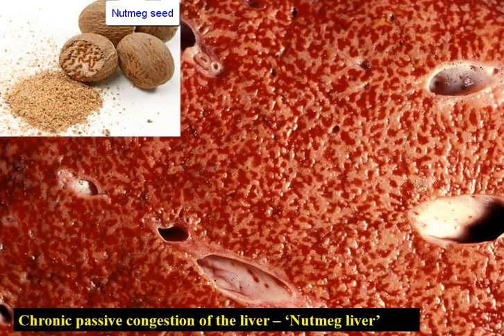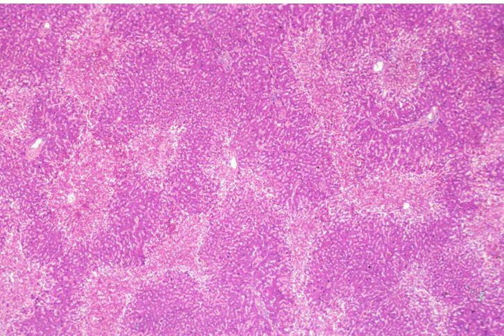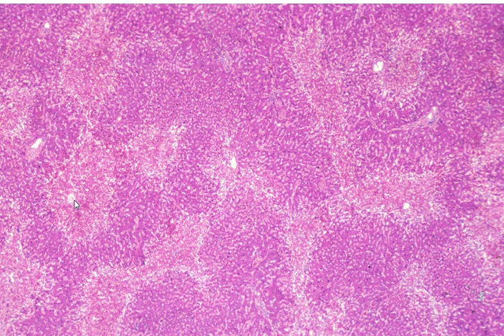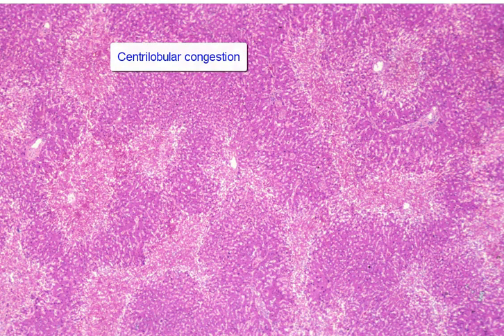So what does nutmeg liver correspond to? If we examine this under the microscope, we will see there are two different colors in the areas I am highlighting here. These are areas of marked congestion, and again another area here, and these are around the central vein. So this is due to chronic venous congestion.